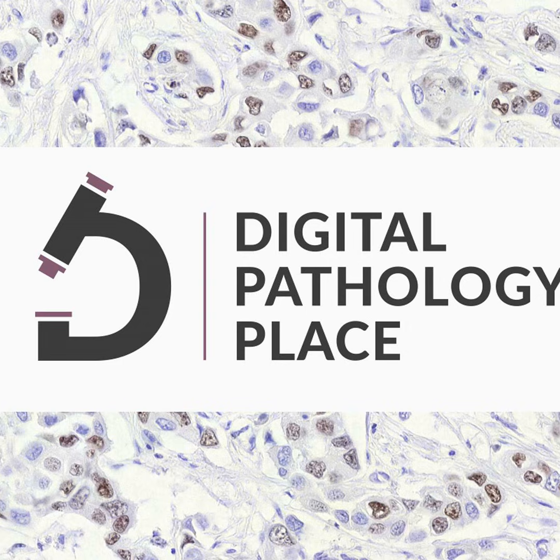Yeah, and that basically is a function of the lack of precision of human vision. Basically, we can overcome that hurdle with computers. Right. Now, that's not to say there aren't numerous challenges in it. Of course. I think at this point, it's still a pathology assist tool, right? It's going to be a tool the pathologist uses to make the measurements. The pathologist is going to see markups in images that give them an idea of what's been scored and how it's been scored, so they can verify that they agree with the decision of the AI model.